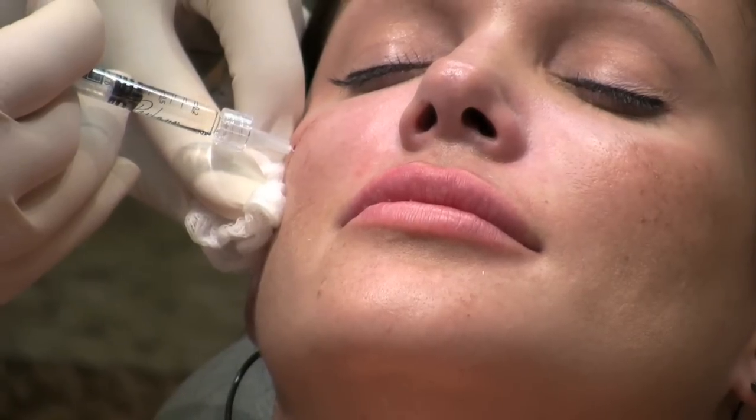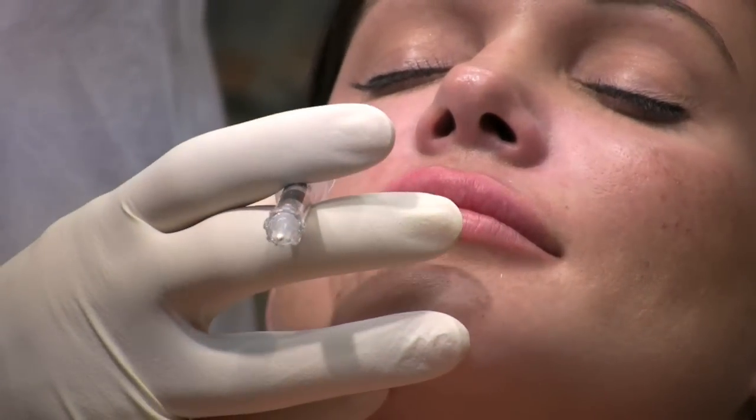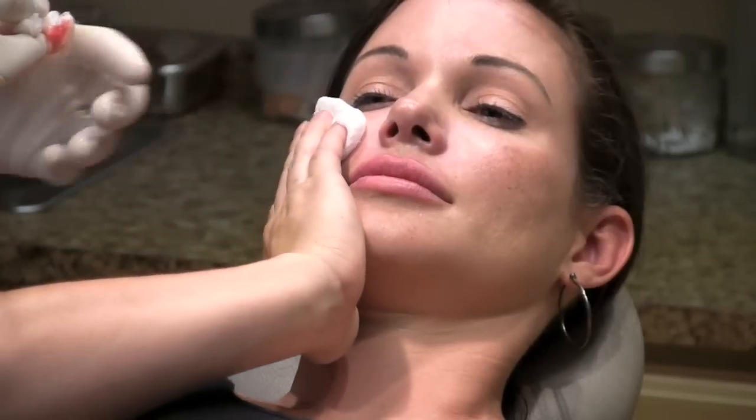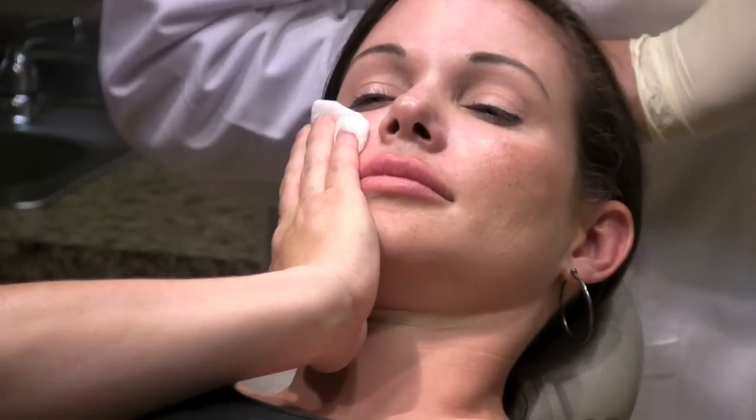Doing okay? And after I inject it, I just massage it again, smoothing it out. I don't feel any lumps or bumps. Perfectly smooth. And you can actually compare the 2 sides right now. You can see the fullness. Holding a little bit of pressure stops these tiny little vessels. So what I do at this point is I hand the patient a cold, moist sponge, and I go on the other side.